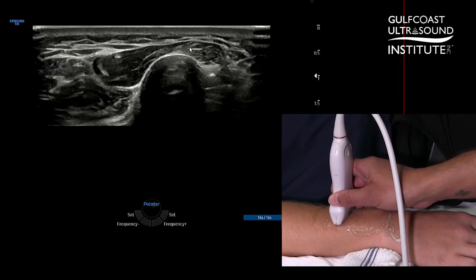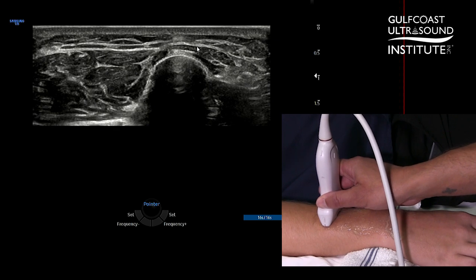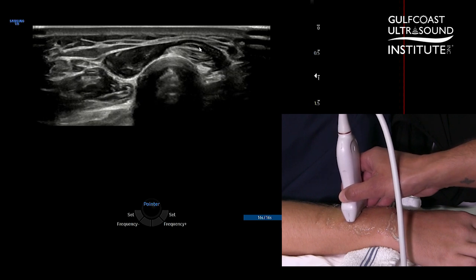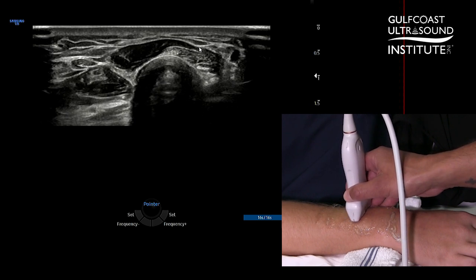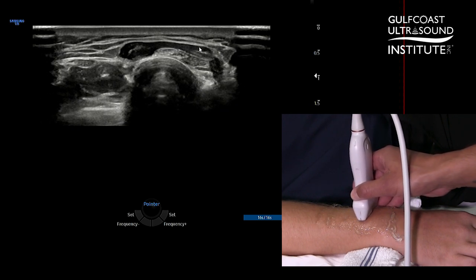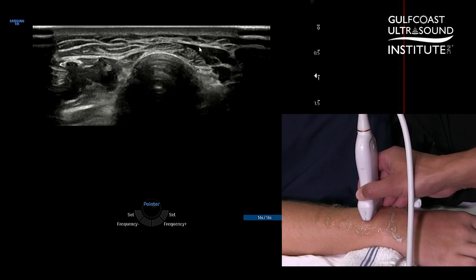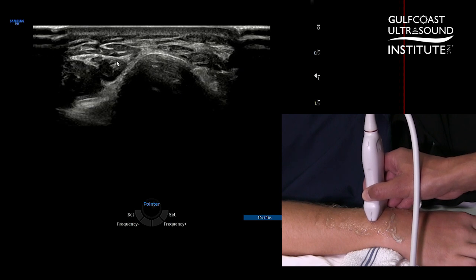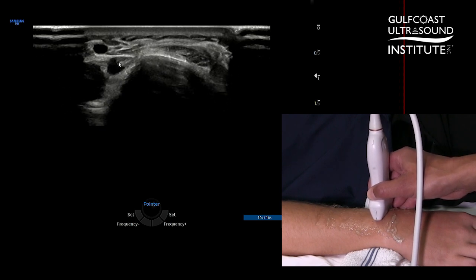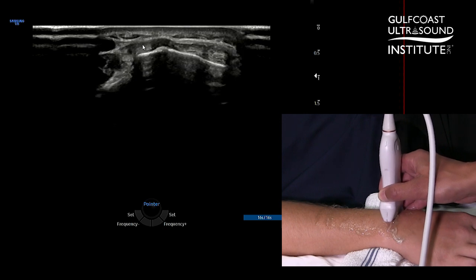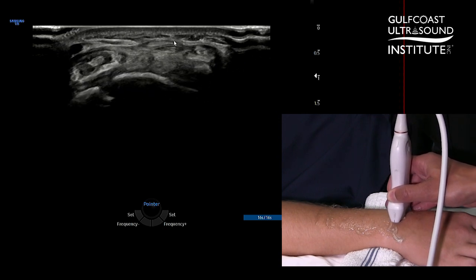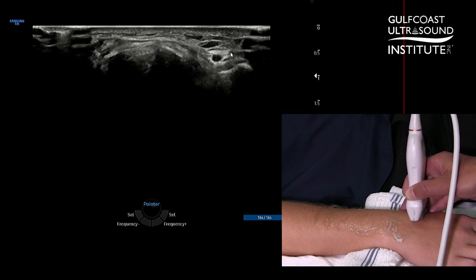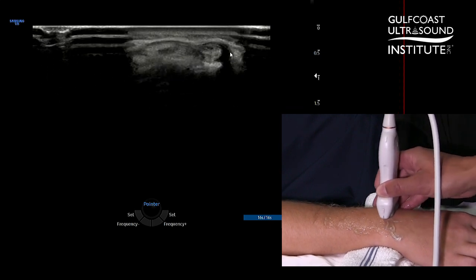Then as we scan more distally, we can see compartment one crossing over the top of compartment two. And then continuing distally, compartment three containing the extensor pollicis longus tendon will cross over the top of compartment two as well, heading over to the thumb. This being the less common of the two — the distal intersection syndrome — looking for the same things. And this can mimic de Quervain's tenosynovitis or snuff box pain with a scaphoid fracture.